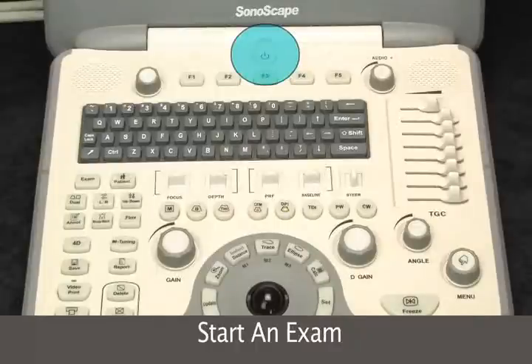So now we'll power the system on. It may take a little bit longer than what you're accustomed to with other machines because this is a very software-driven system.